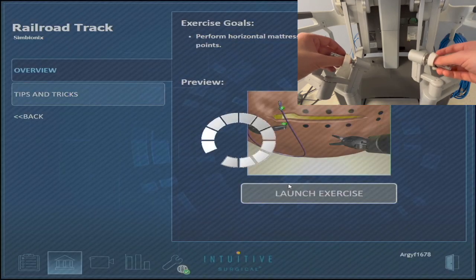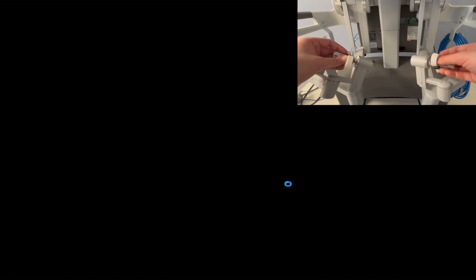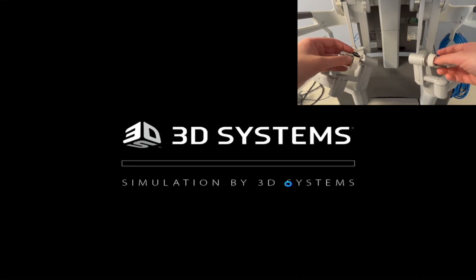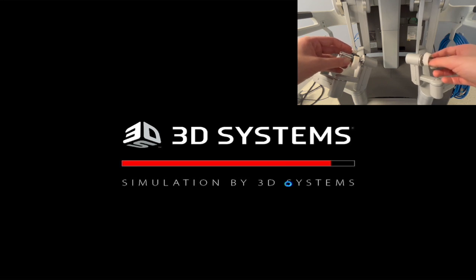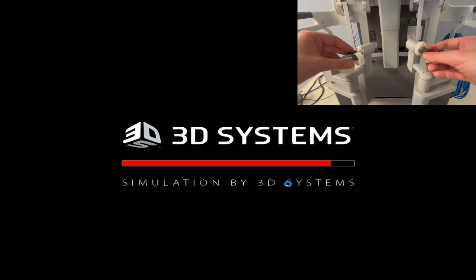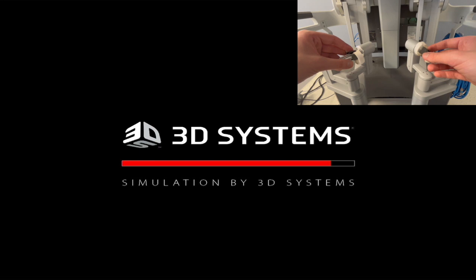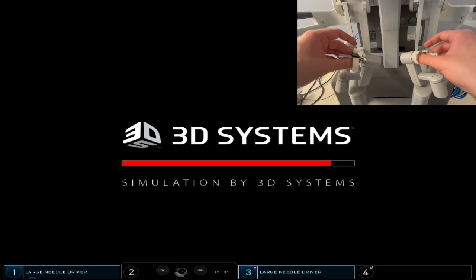Hello everyone, this is a video tutorial of the railroad track exercise on the robot. This is one of the most useful exercises out there because it practices needle point awareness, suture loop awareness, and bite planning.